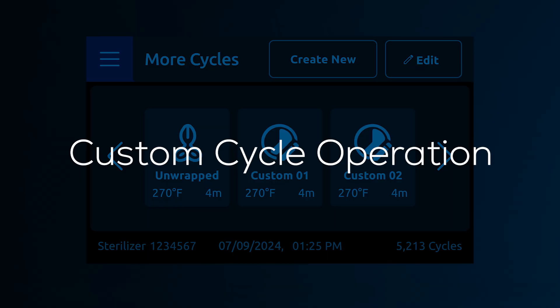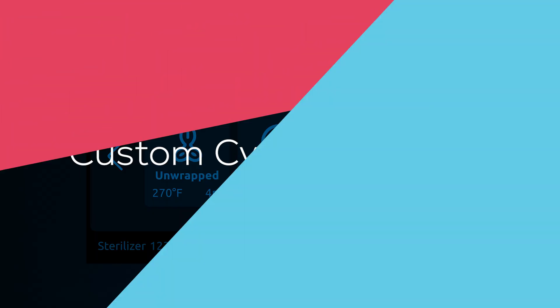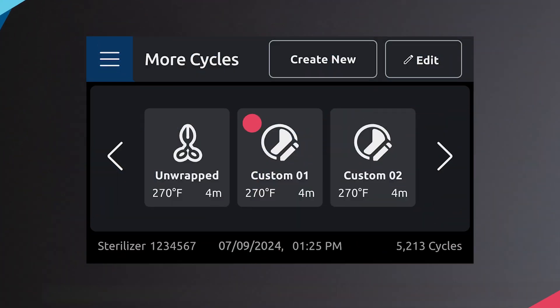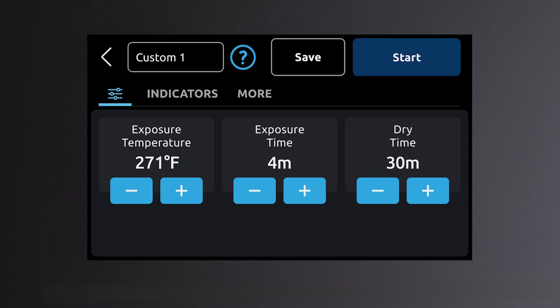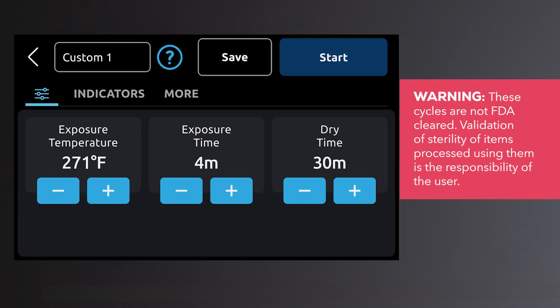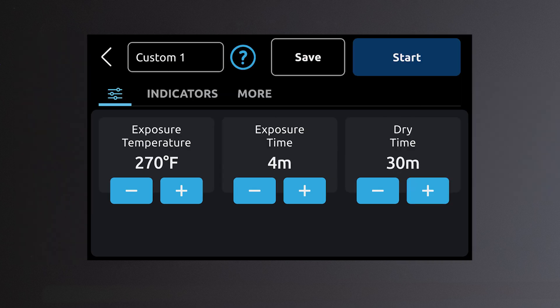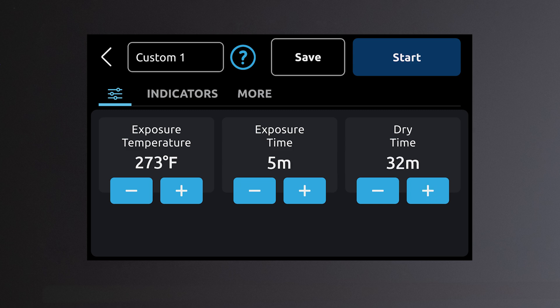Custom cycle operation. The custom cycle can be used for custom applications that are not covered by standard cycles. These cycles have not been FDA cleared for medical use. The custom cycle allows the cycle parameters to be adjusted or changed to follow instrument manufacturer's instructions that are outside of Midmark standard cycle parameters.